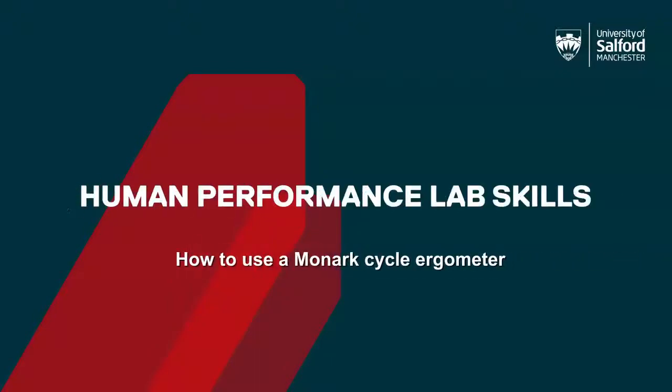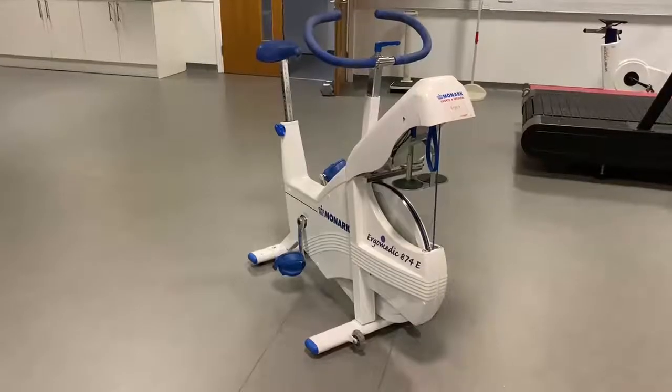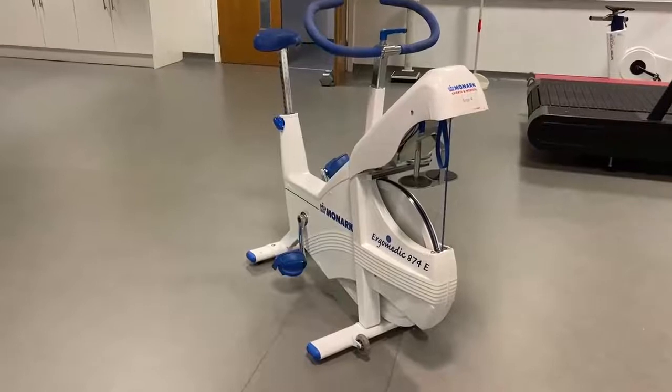In this video we'll look at how to use a Monark cycle ergometer. In the exercise physiology lab we have a selection of Monark cycle ergometers, including one which can perform a Wingate anaerobic test on.